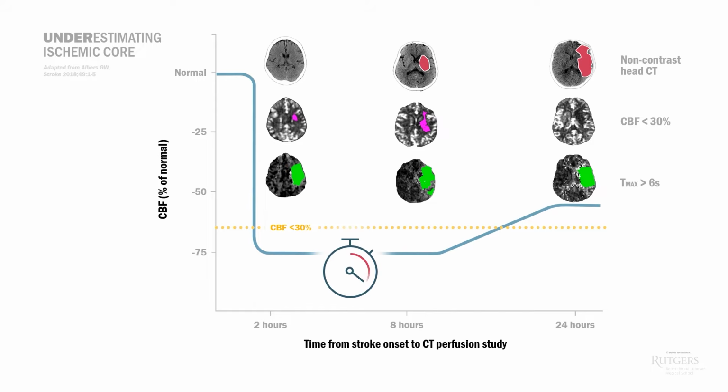They only reflect the hemodynamics at the moment the scan was done. So if the CTP is performed at a primary stroke center and the patient is transferred to a thrombectomy-capable center, by the time that patient arrives, the initial CTP may no longer be valid, especially if there's significant transfer delay. So you might have to repeat the imaging.